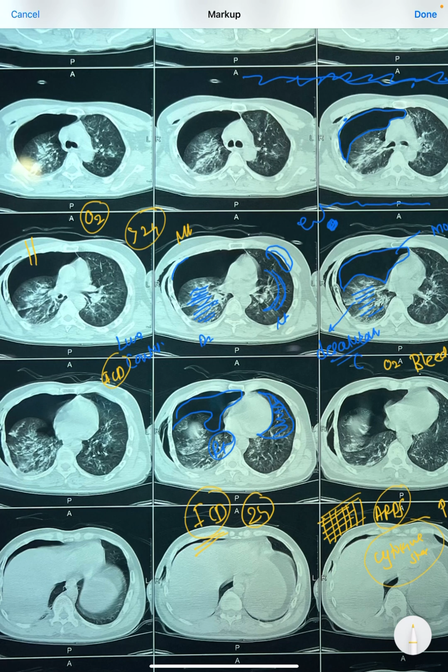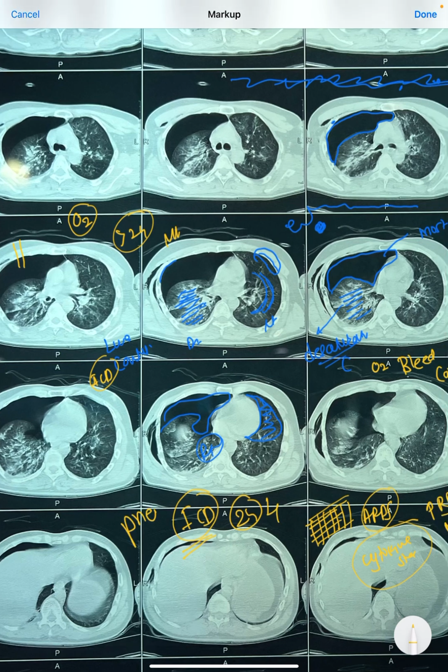If the X-ray shows marked improvement in the pneumothorax, very commonly after 48 hours, and if the pneumothorax completely resolves, then the ICD can be removed, or the ICD is clamped for 24 hours and again an X-ray is taken. If the X-ray does not show any pneumothorax, then the ICD can be safely removed.